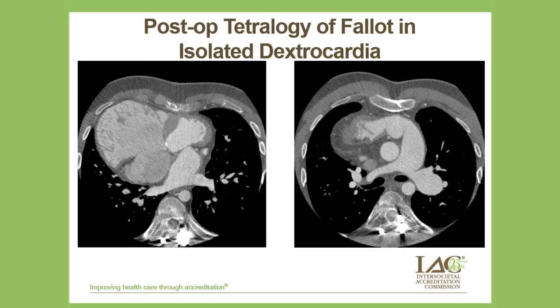In a 53-year-old man with a history of previous thoracotomy presenting with intermittent chest pain, the dilated and trabeculated right ventricle forms the right-sided cardiac apex, supporting the pulmonary artery with proximal left pulmonary stenosis and post-stenotic dilatation, while the right pulmonary artery is hypoplastic. Calcification in the interventricular septum indicates a prior surgical VSD repair. Putting this together, we have surgically repaired tetralogy of Fallot with isolated dextrocardia. The coronary arteries were normal.